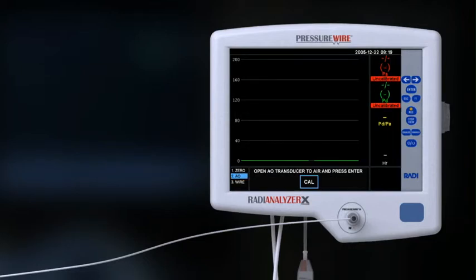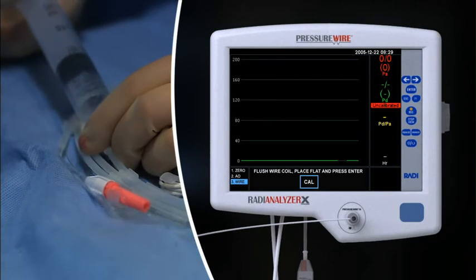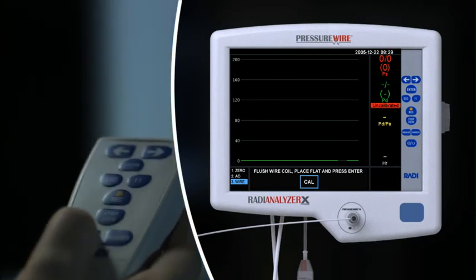Open the AO transducer to air, then press ENTER. Flush the wire coil, place it flat, and press ENTER.